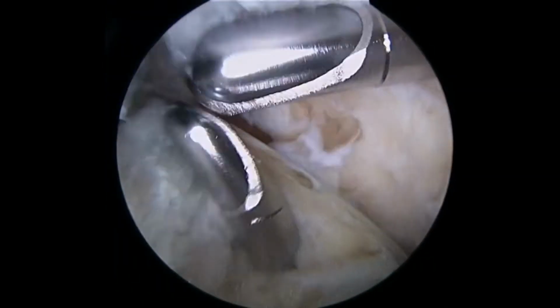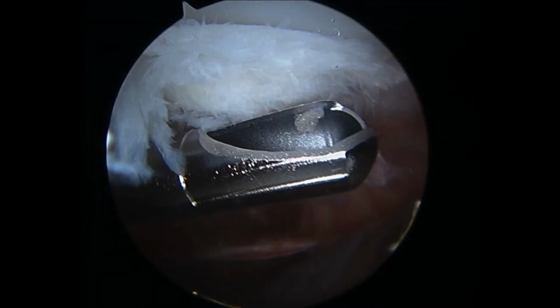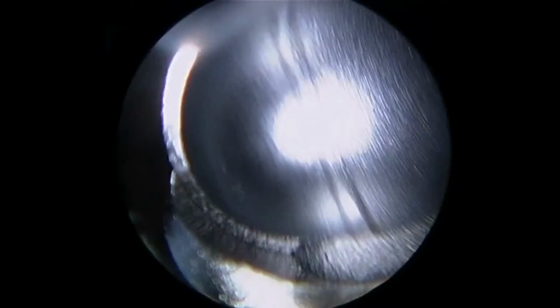And when we do knee replacements, people are always confused how we handle the patella. So the patella is just resurfaced with a 9mm plastic piece. So if a normal patella is like 25 millimeters thick, we're taking off like 9 to 10 and replacing that 9 to 10 with a piece of plastic. Now you're starting to see the plastic on the top, and this is where the scar tissue was underneath the kneecap. Now this tool here is like 5 millimeters. So right up in here above the kneecap, which is in the back here, I'll start working on that, where all that tissue was being caught.